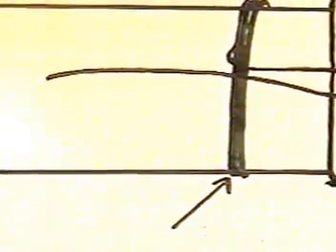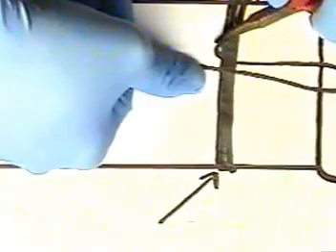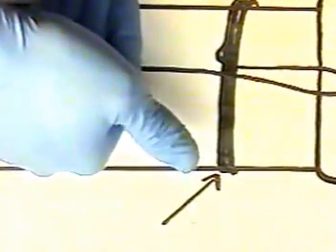This is an illustrated representation of applying the thread binding onto the bending rubber sheath over the bending section. Again, the first loop will be put underneath your thumb, as shown here. You will take your needle nose pliers and pull on one thread until this loop is drawn underneath the threads. You will feel which thread it is, most of the time underneath your thumb. Again, find the thread that will pull underneath the 3 to 4 bindings, and you'll pull that until it goes all the way through, but not far enough where you will pull the binding completely out.